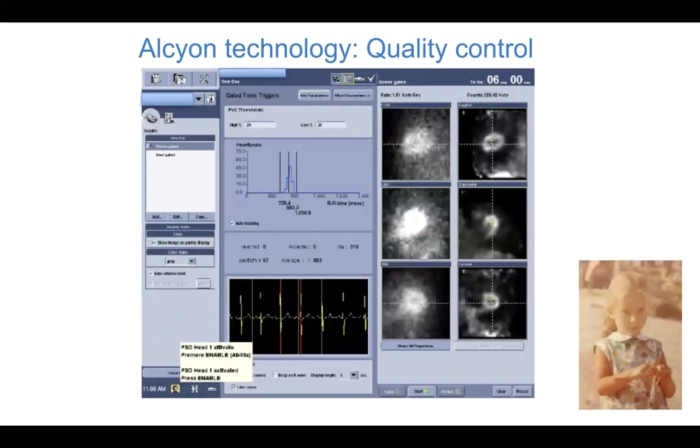And what about the quality control? The quality of SPECT acquisition should be checked systematically on the dedicated tool of the workstation. The scan quality control provides two options for performing quality control on slice data: quality control with organ and/or body views, and gated quality control. Scan quality control is necessary to view stress and rest projections of the slices, and the output displays guidelines indicating the centers of the system field of view.